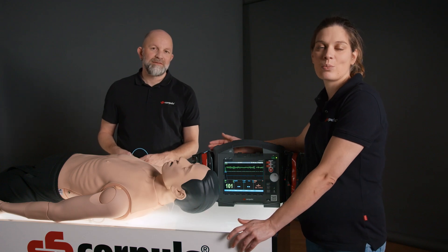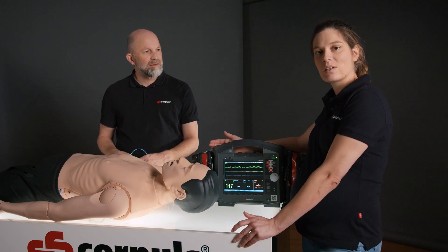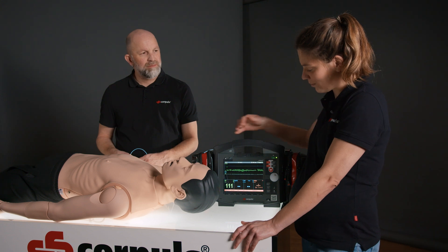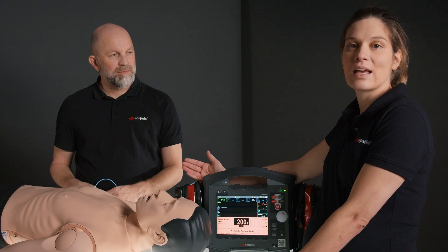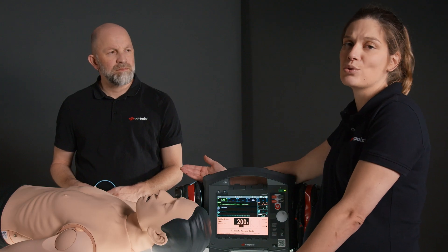We would like to begin with defibrillation in AED mode. To do this we access the AED mode by pressing the corresponding key, then press Analyze. The device now prompts us to apply the therapy electrodes and then press the Analyze key.